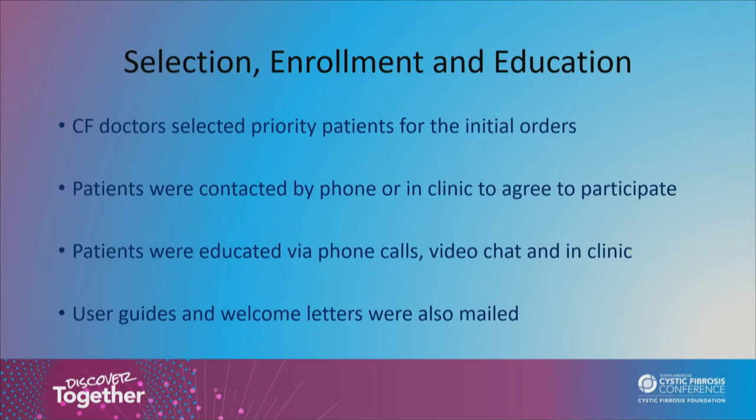And we also mailed the user guide that was provided with the spirometers. It's about 12 or 14 pages in detail, whether it's an Android or an iPhone, how to set it up, how to download the app, how to put your demographic information in. So we did make a pretty comprehensive attempt to get as much information to the patients as possible. It's also good to note that this did change a little bit over the year and a half that we set this up.